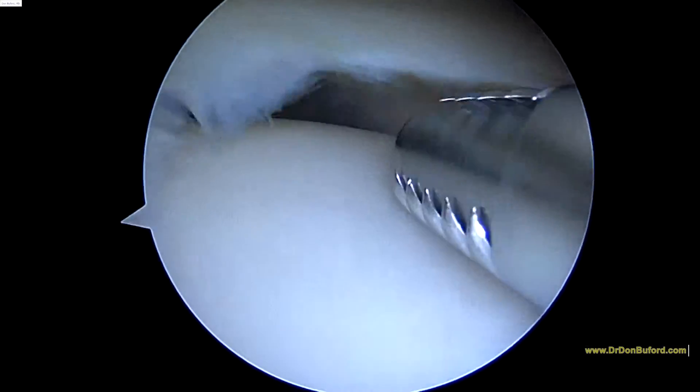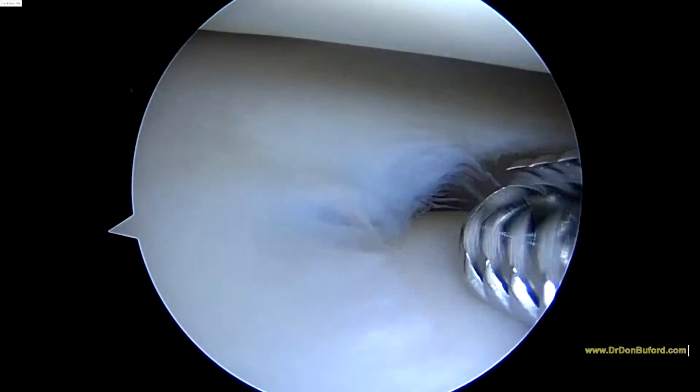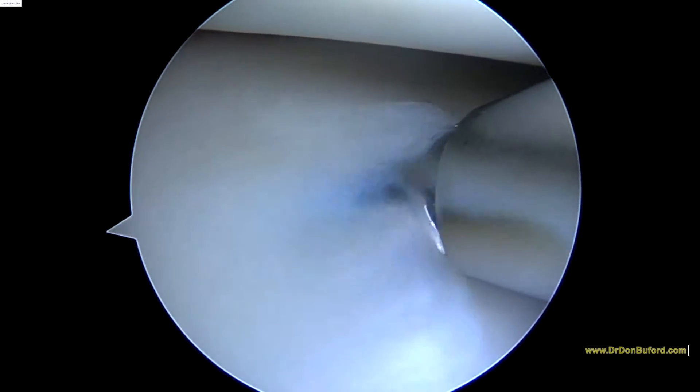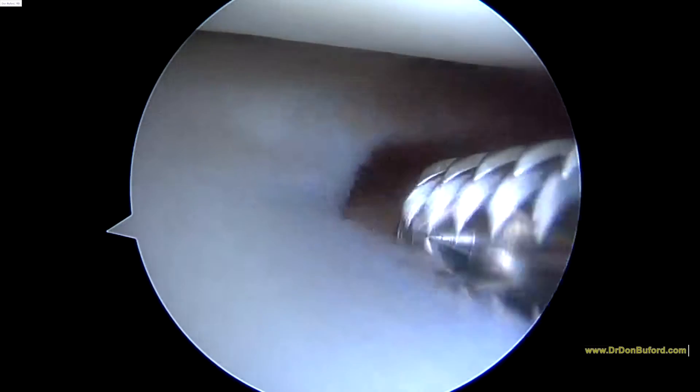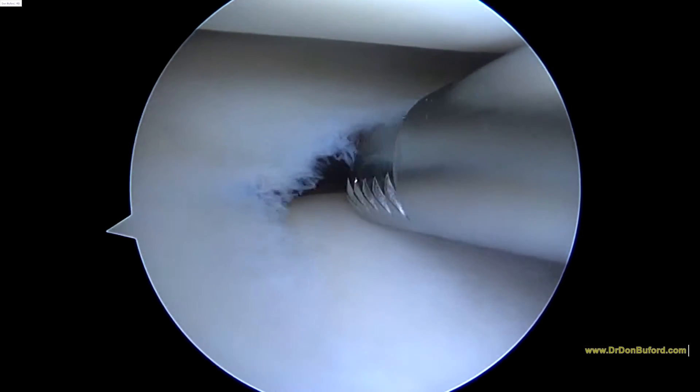So now we're looking at the lateral compartment. You can see a little bit of fraying on the inner edge of this lateral meniscus. And you can see how quickly the shaver can help smooth that out and make sure there's nothing that's loose that can catch.